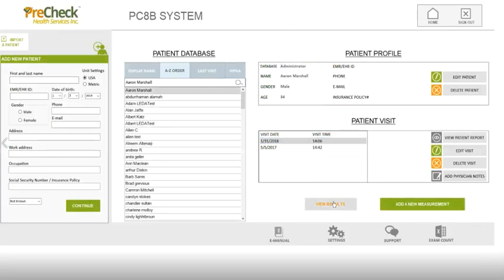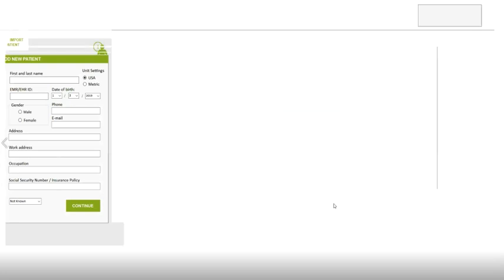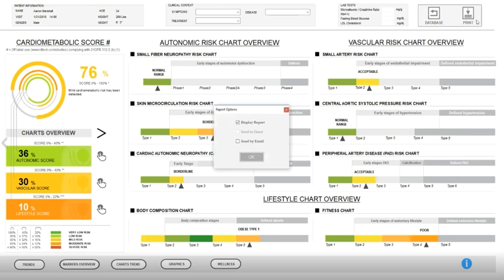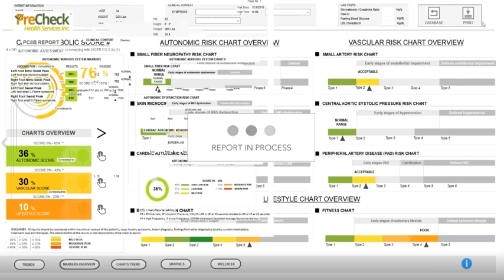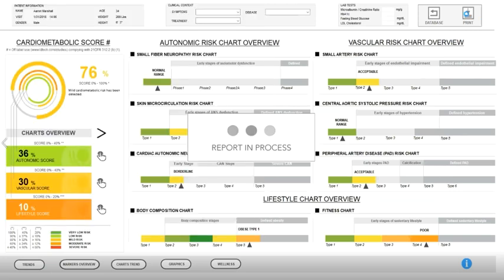Now this result, as you've seen the system, as you use the system, you know that you'll go here to print this particular result. You'll see the icon here, print. It'll populate in PDF.